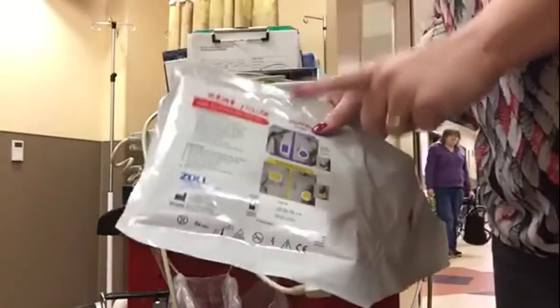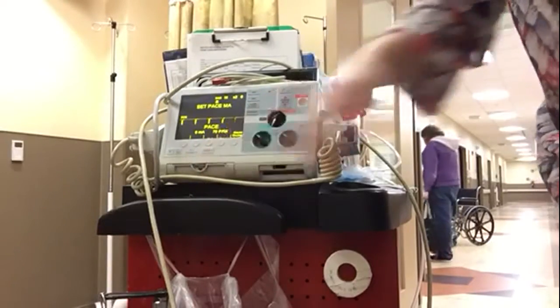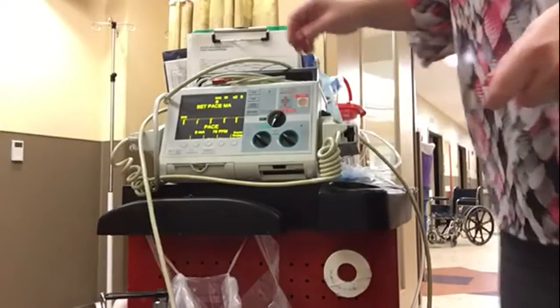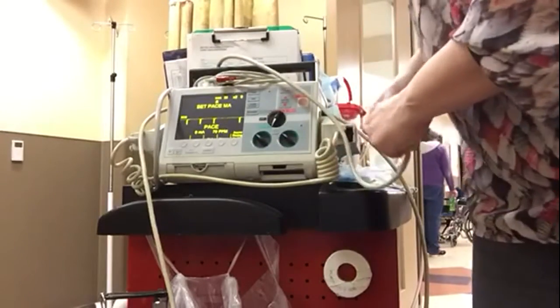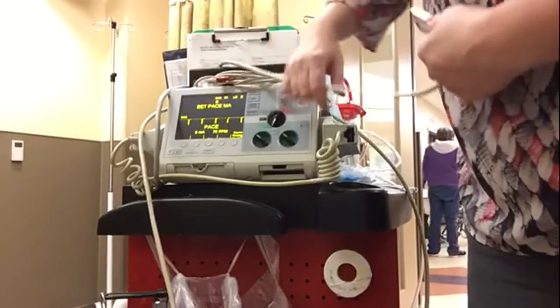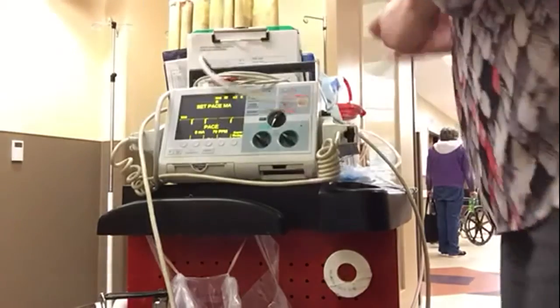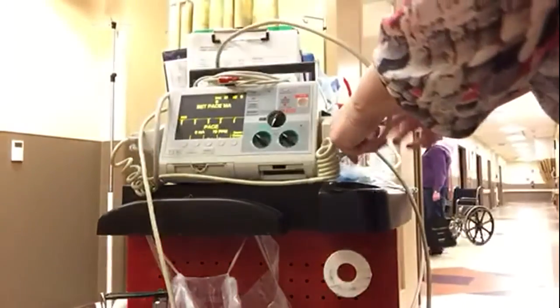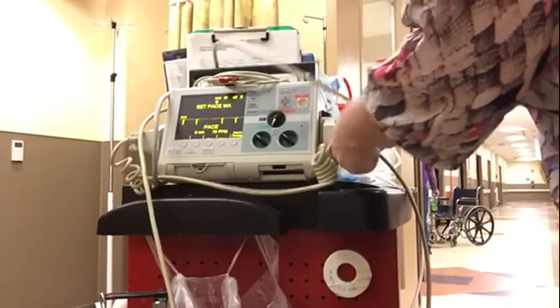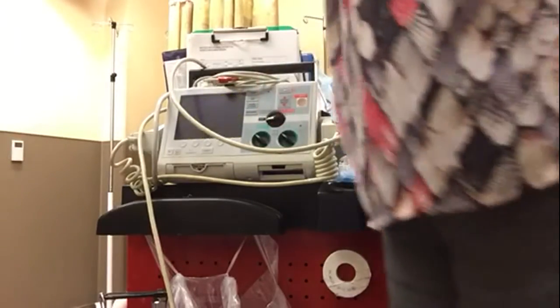To pace using these pads, you'll need to set the milliamps and the beats per minute. I always suggest starting at 60 milliamps and 60 beats per minute — it's a good number and easy to remember. Then go up or down depending on patient comfort, patient symptoms, and overall status. Give the least amount of energy for the most benefit.